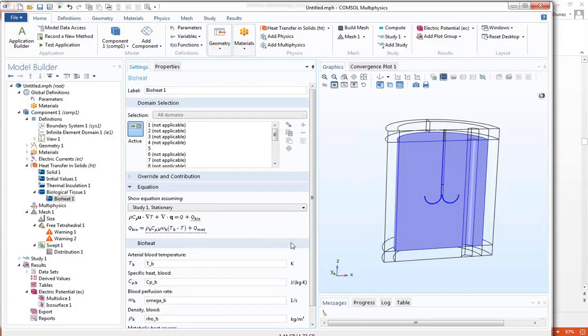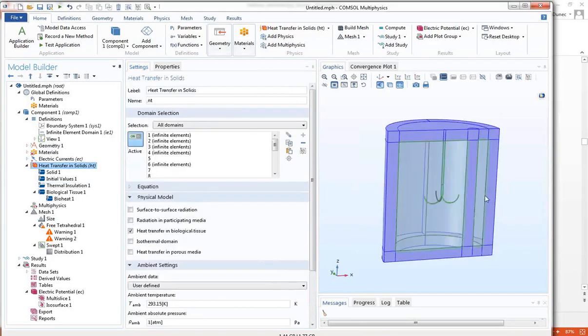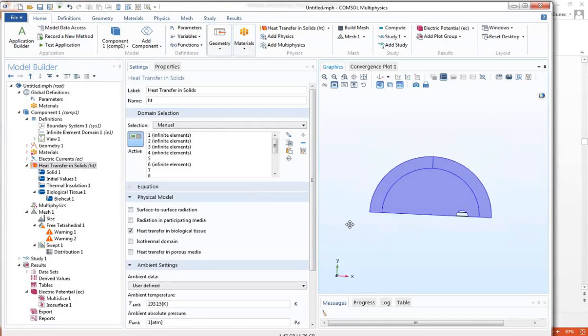Okay. Now, if there was a metabolic thing going on, I could actually put a heat source in there if I wanted to. Now let's do a few more things in the heat transfer. I'm actually not worried about what the temperature in the artery is. So let me not calculate, whoops, I do want to do that, okay, in the artery. And instead what I'm going to do is just set a boundary condition there.